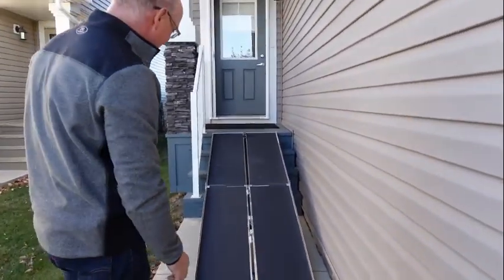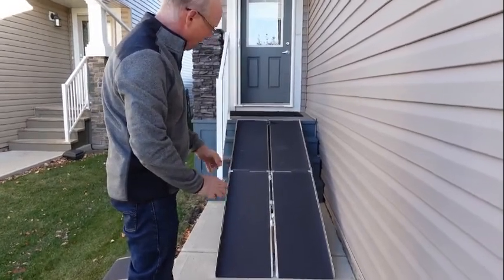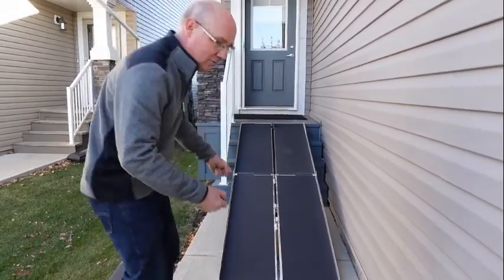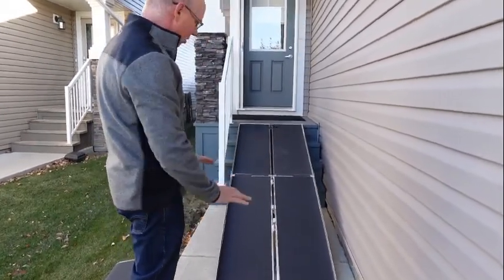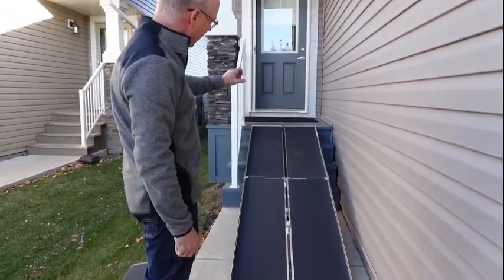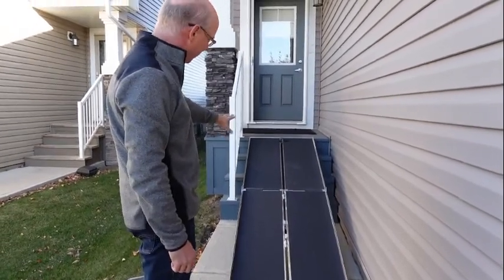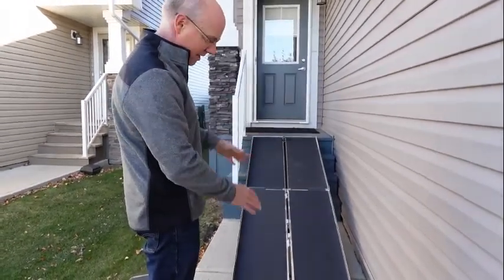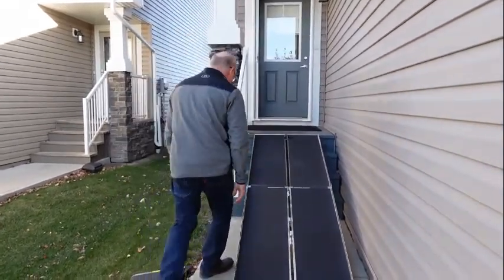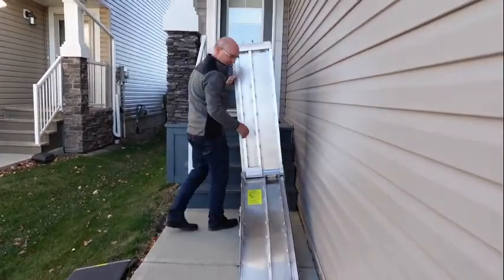But it's steep — this is too steep. You've got to remember you're going up and down this ramp with somebody in a wheelchair, and depending on the weight of the client, it gets steep and they'll take off on you. So you've got to go a little bit longer. This is a nice solution to get in there, but I'd go 10 or 12 feet for sure. We'll put this away and talk about thresholds.